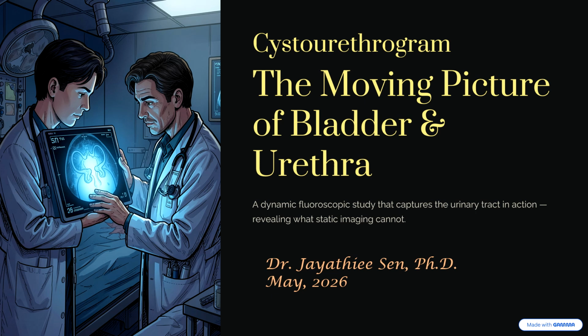Hello everyone. Today's topic of discussion is cystourethrogram, which is also known as the moving picture of bladder and urethra. It is actually a dynamic fluoroscopic study that captures the urinary tract in action. Means when the urinary tract is voiding or when it is filling, what type of activity it actually does, that is totally revealed by this cystourethrogram. So for that reason, it is termed as the moving picture of bladder and urethra.